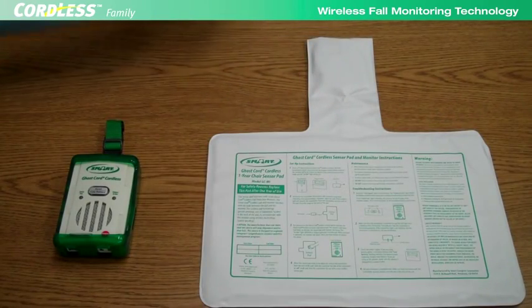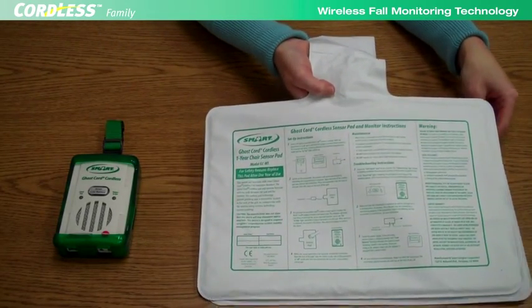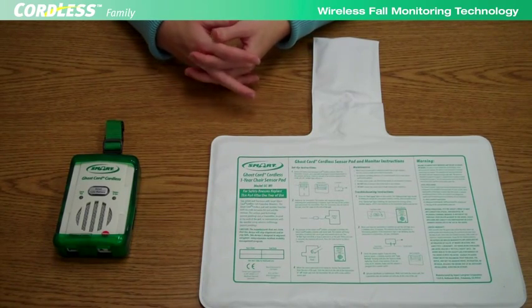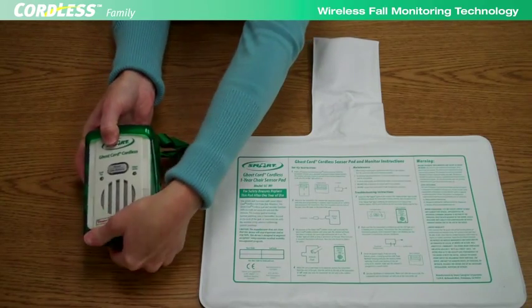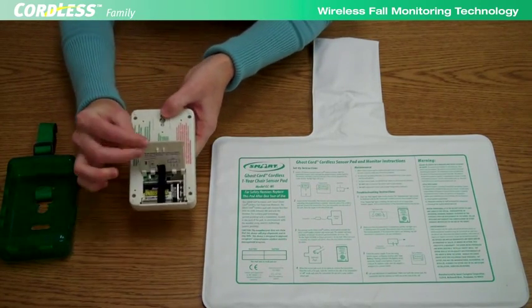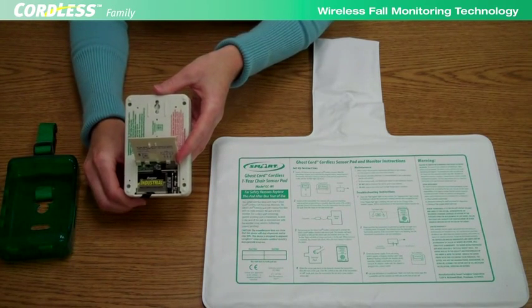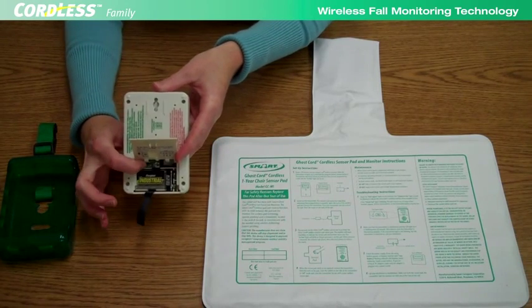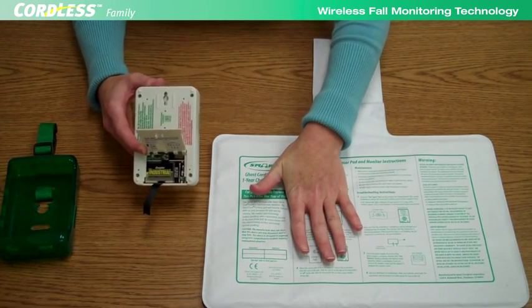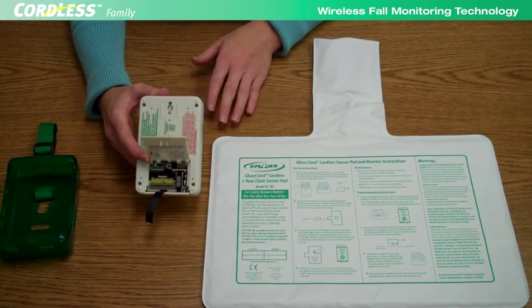To program a cordless pad to a cordless monitor, such as when a pad is being replaced, have the new pad and the monitor within reach. Open the panel on the back of the cordless monitor to access the program button. Press the program button — the monitor will produce three short beeps. Place pressure on the cordless pad and then release pressure. The monitor will sound one long beep indicating that programming is complete. Close the battery door.